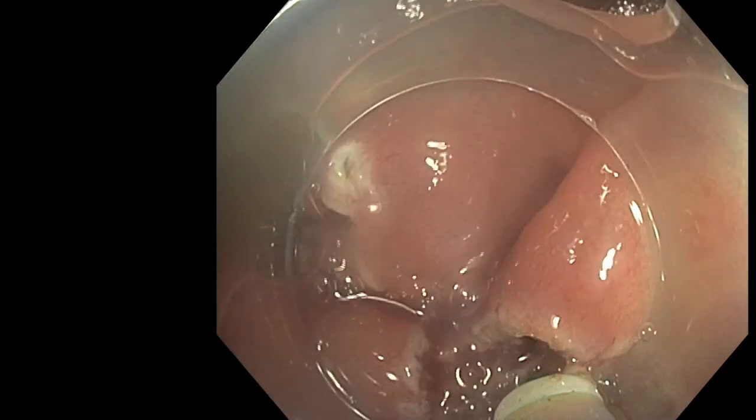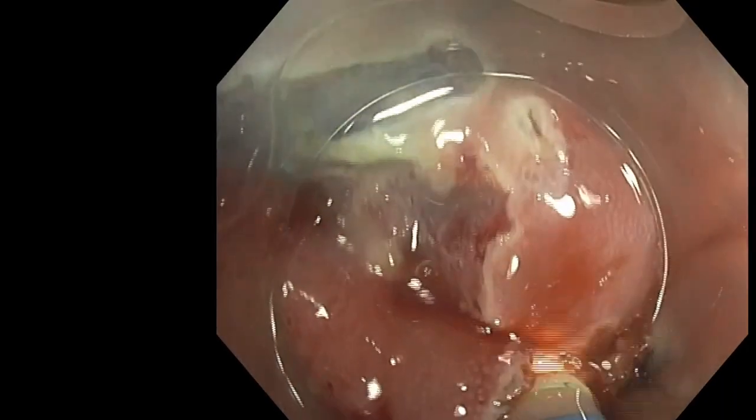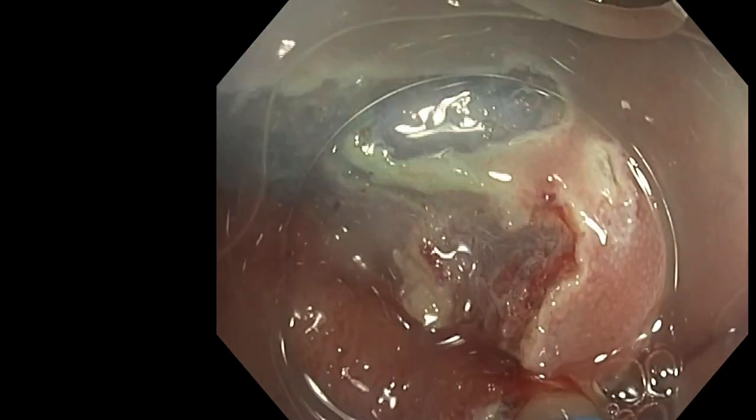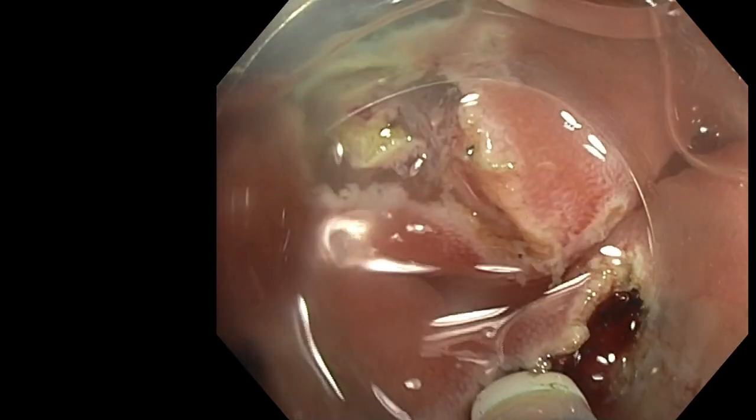So a small bleeding is coming. It's usual. Commonly you can have this kind of bleeding on the sides of the diverticula more than at the bottom of it. And once again, I should cut, but very slowly, with a movement of pulling back the knife.